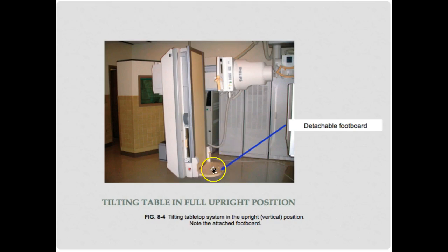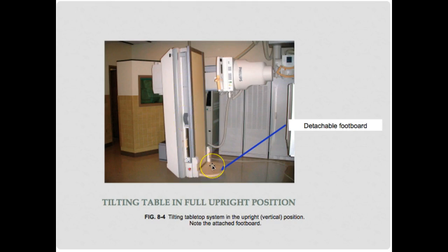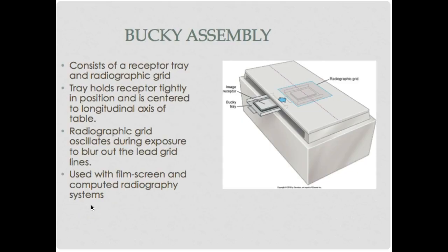There's a detachable footboard, shoulder harnesses that clip on, and little handholds that clip onto the table. When doing fluoro you need to take your Bucky tray all the way down to the end, and there's a lead-lined Bucky tray cover right there. You'll have shoulder harnesses for Trendelenburg and handles as well — there's a bunch of different accessories that can attach onto this table.